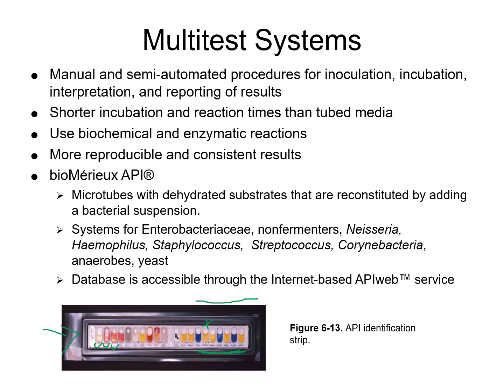And so you're basically doing all of those tests at one time. And then after you interpret the results of those tests, it's going to give you some sort of numerical code. And then you will enter that numerical code into the database, or you'll look through a book that has those codes, and then that code will actually translate out to a particular bacteria or organism.